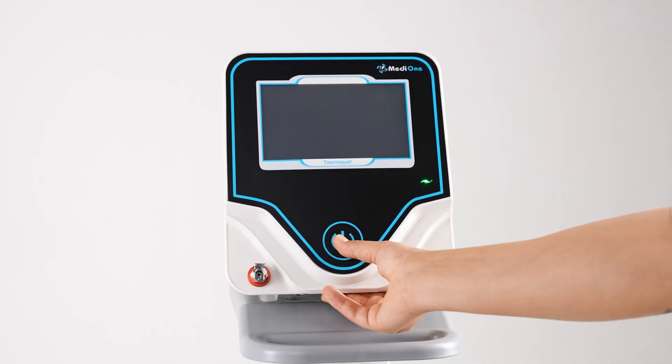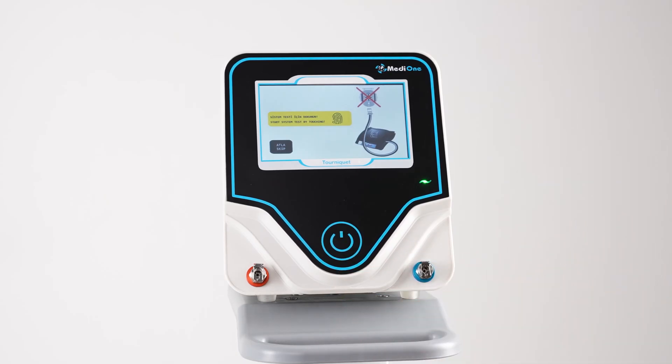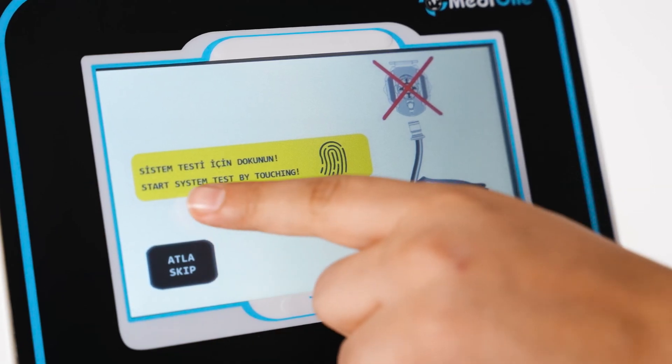Press the power button on the membrane for two seconds to turn on the device. When turned on, it asks whether to perform software and hardware self-checking. If you want to skip, press the skip icon. For self-check, tap anywhere on the screen.